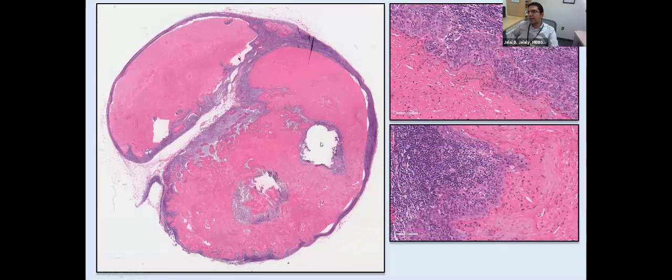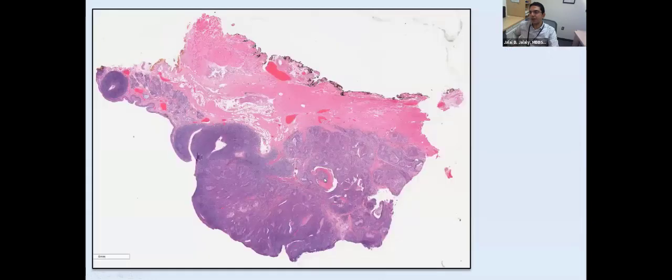You can see here that even though now it's obviously malignant and squamous cell carcinoma, when you get a small, tiny, fragmented biopsy like I showed earlier, the diagnosis of malignancy can be a challenge, and if you're not thinking about it, it can be a pitfall. But fortunately, looking closer at these lesions with cytology, you can definitely arrive at a malignant diagnosis.